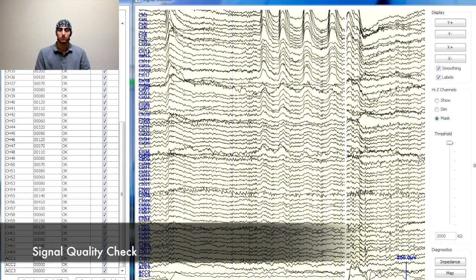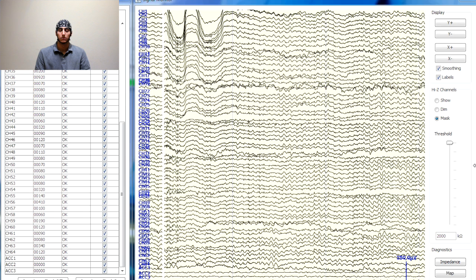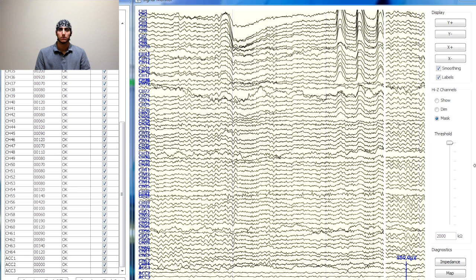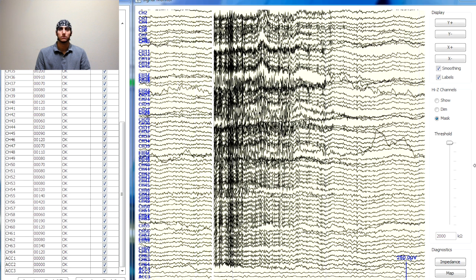After applying the cap, start the data acquisition software. The system includes a live impedance check to make sure all the electrodes are contacting. You can also view the raw EEG signal in the display window. The EEG traces are displayed on the top, and the output of the onboard 3-axis accelerometer is also shown at the bottom of the window.